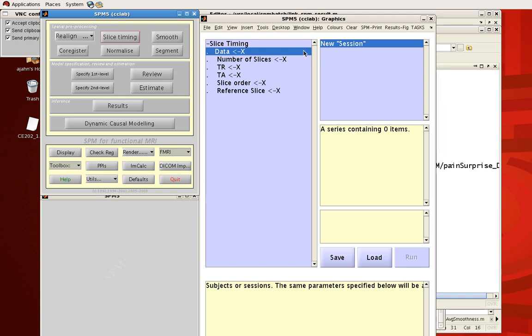So within this, in this graphics pane, this opens up all the nitty-gritty options within each of these buttons. And what you'll see is that there's an X in any field that is required to be filled in. So you need to take care of these fields before you can hit the run button or else it's grayed out.